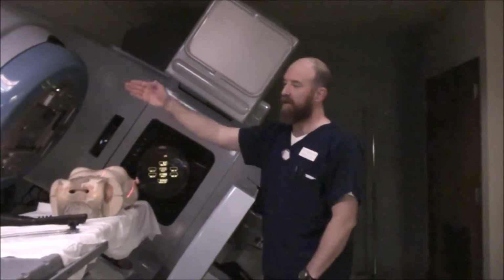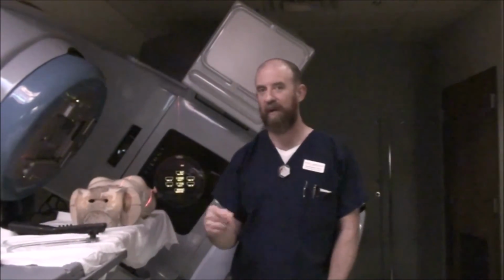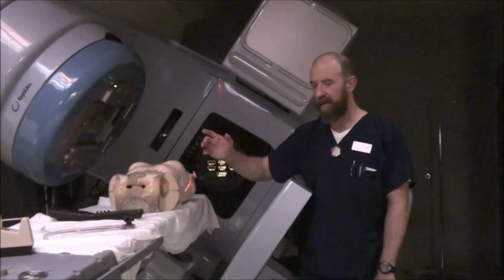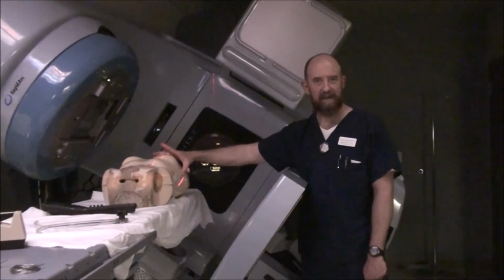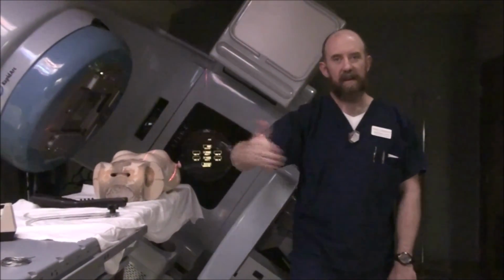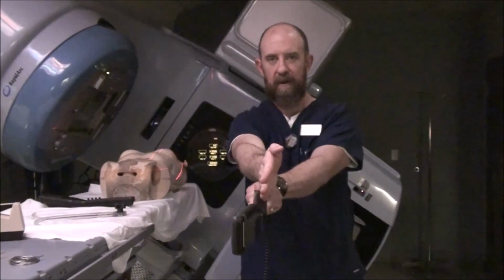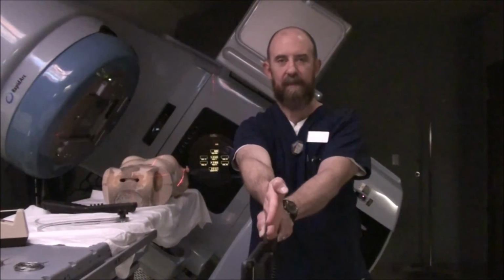So you're dealing with the opposite edge, you have to do opposite things because your divergence is upside down from what it was before. Is that confusing? Okay, so kick the table, mirror the table, don't crash, don't kill. Those are the things that you have to remember. All the rest of it is the same. You just have to deal with the table angle versus the superior field edge that you're having to eyeball and show radiographically with a wire that your superior field edge and your wire are not diverging from one another. They're overlapping and superimposing.